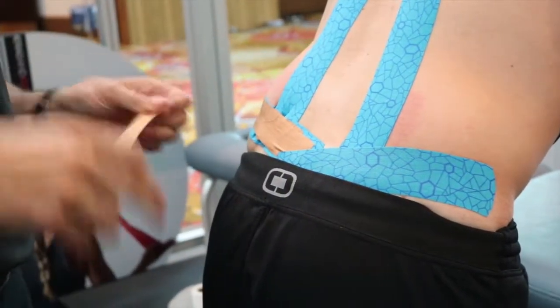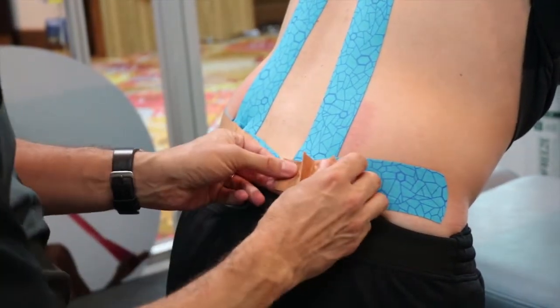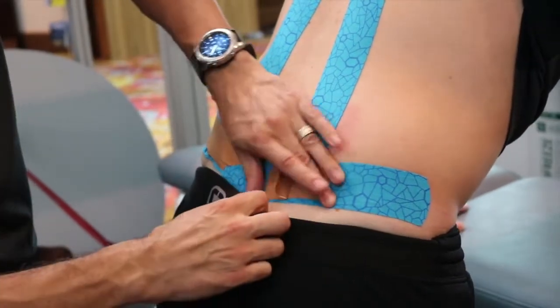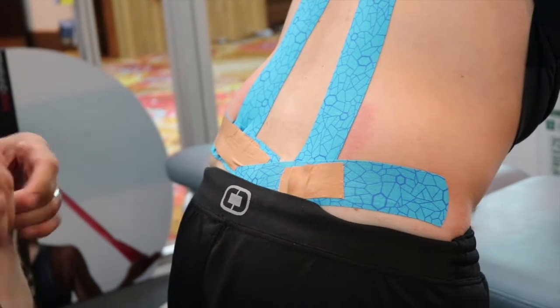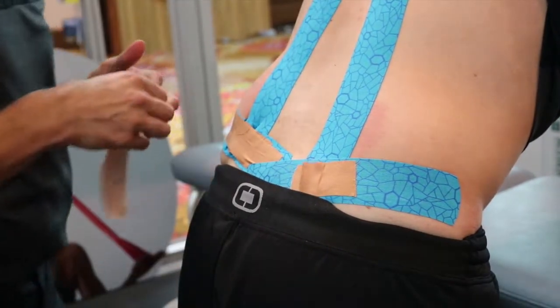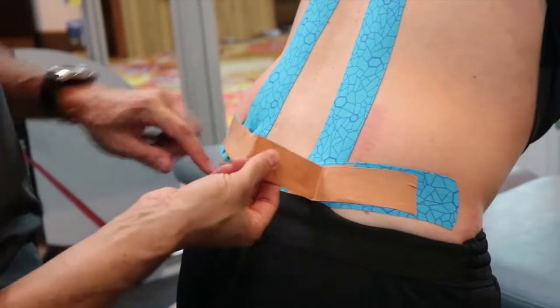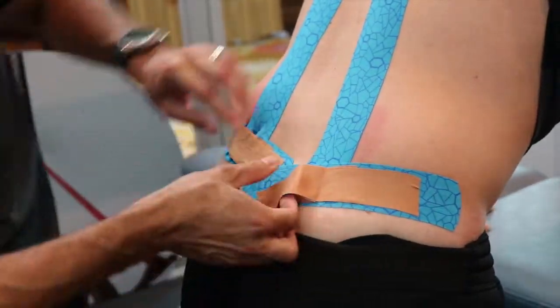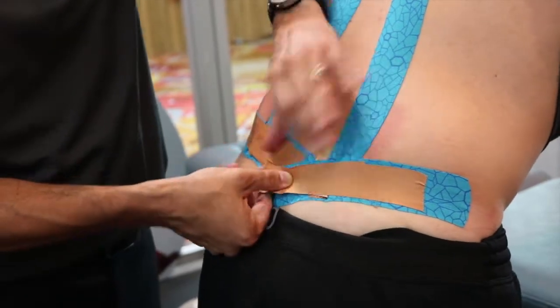And now this was the anterior side. So we're going to place our tab down, except this time instead of pulling from back to front, we're pulling from front to back. Once again, catching that tab. We're just going to move that down just a little bit. Finger in front, pull directly over.